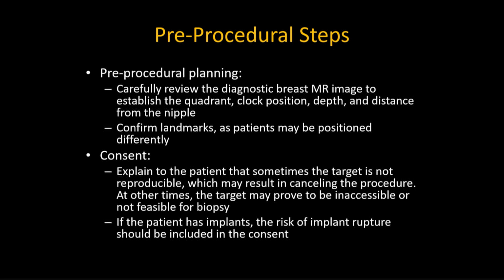You want to know what quadrant you're in, what's the clock face, what's the depth, the distance from the nipple and the skin. And that's because patients can be positioned differently in the MRI magnet after the patient is in the grid and with compression. And so you want to be able to confirm your landmarks and recognize where you are on the diagnostic MRI compared to your positioning in the breast biopsy.